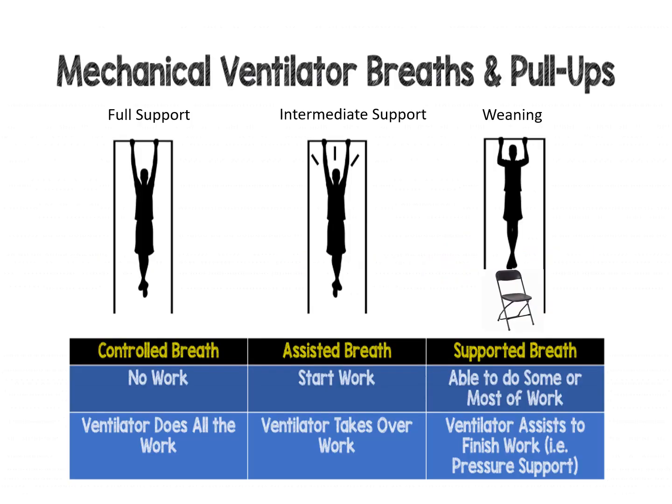There are a wide variety of modes of ventilation. We're going to discuss the levels of ventilator support in the most common modes. There are different variations of how the ventilator will assist the patient, and we'll compare it to pull-ups, I guess, or a breath.